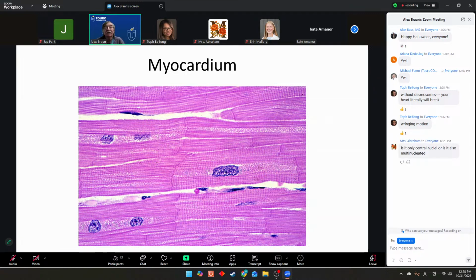Another thing you might see in cardiac muscle, notably again in a perinuclear position, is lipofuscin. These cells are pretty much end-stage cells. You have them for a lifetime, and there's no serious replenishment of cardiac muscle cells from stem cells, although people are doing a lot of research in this area.